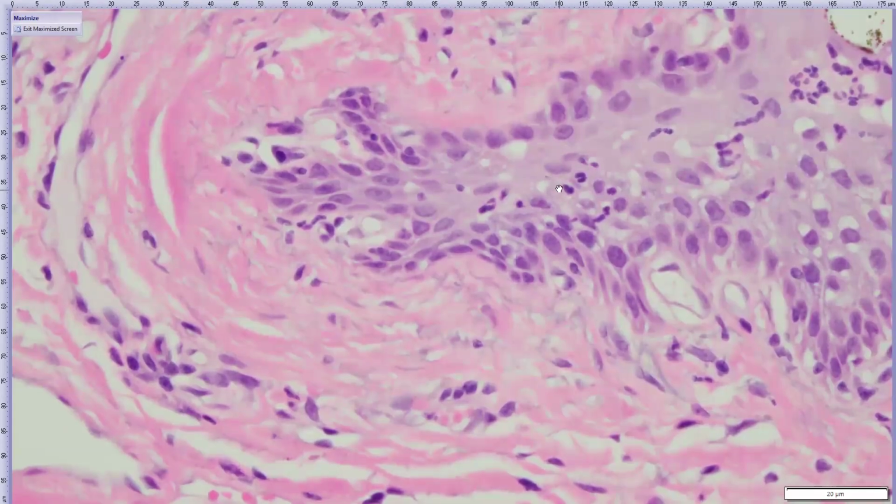So there is a little bit of solar elastosis in this case, or actinic damage. This is UV-induced damage. So it implies that there's been chronic UV exposure to the site. A lot of ocular surface tumors, in dogs mostly hemangioma or hemangiosarcoma, may be solar-induced. So this patient could have had an initial solar-induced tumor, and that could be part of the pathogenesis here, and/or UV radiation may have played some role. So it's worth thinking about that.